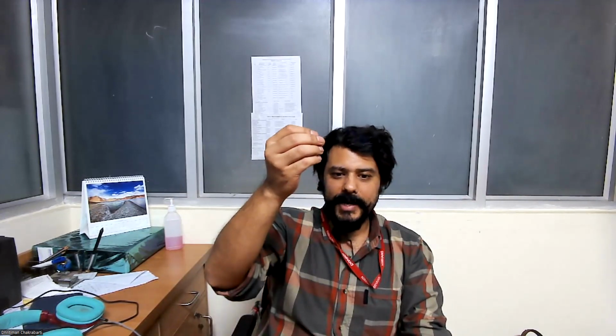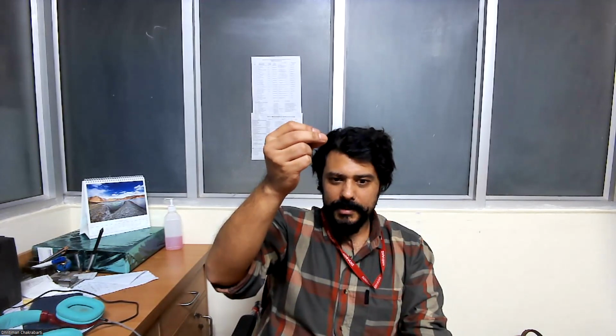Now, the sequences which are generated are based on many different characteristics of how the energy comes back. Okay, so the energy usually comes back at a rate which is sort of exponentially reducing. So this initial sort of energy is used to construct the T1 images.